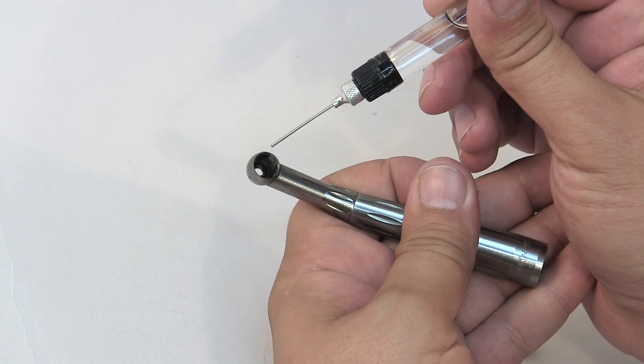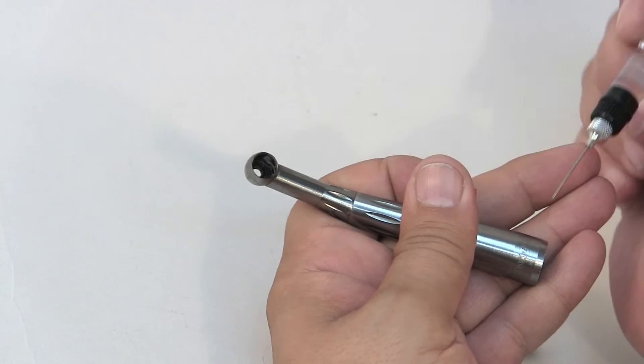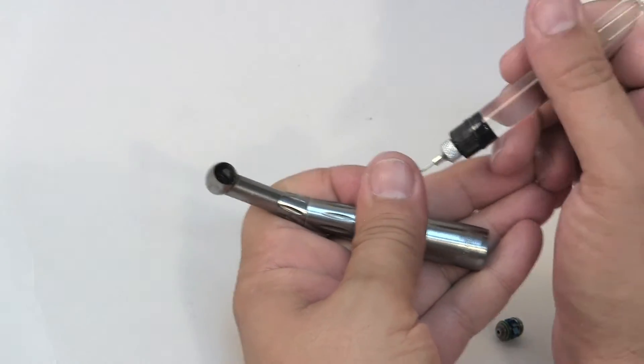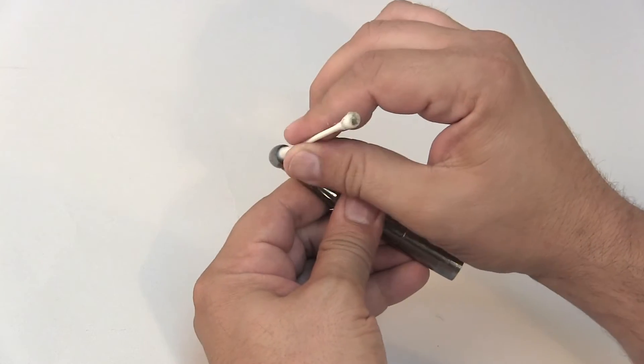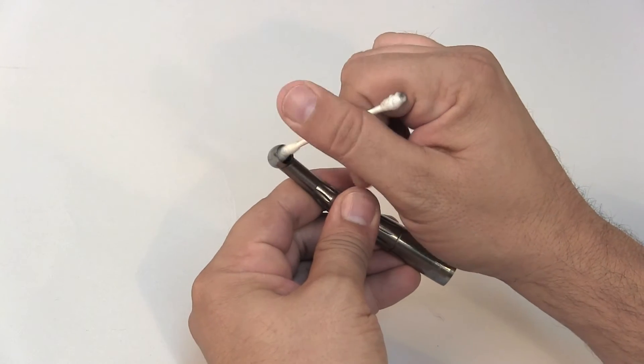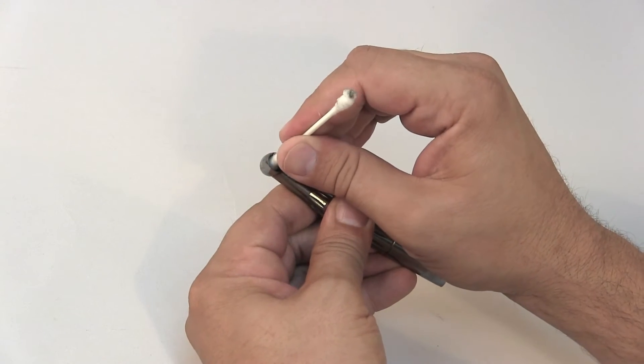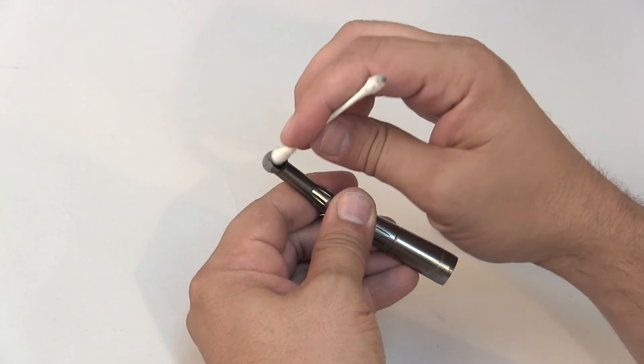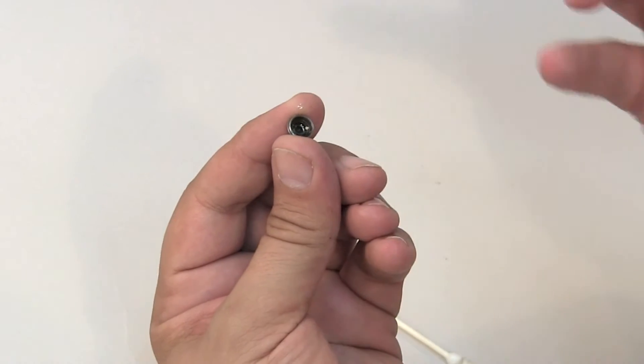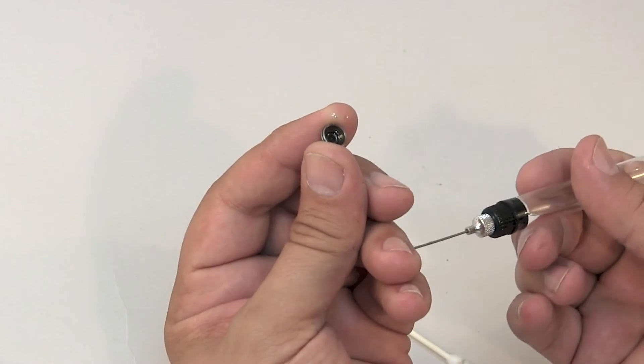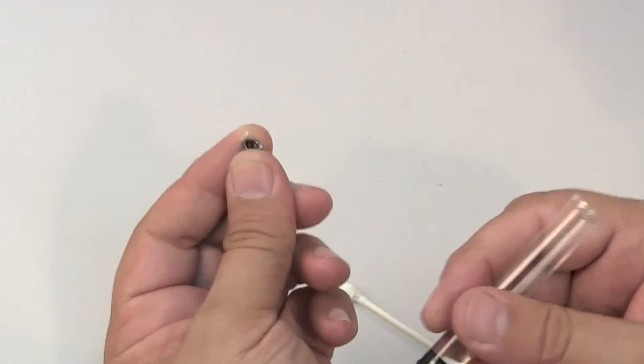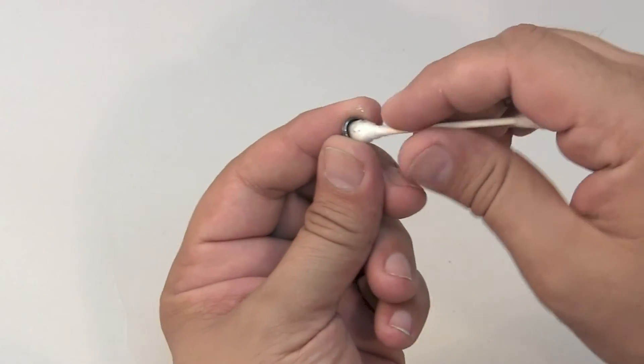Use handpiece lubricant and a cotton swab to clean the handpiece head and the end cap. You can use air from your air water syringe to blow out any cotton fibers that are left behind.